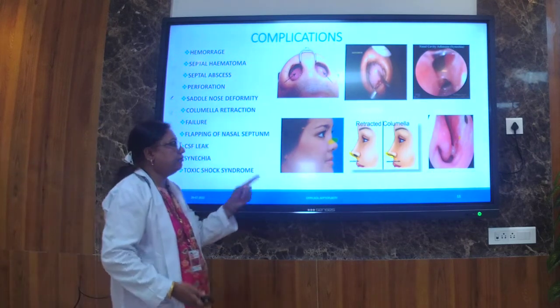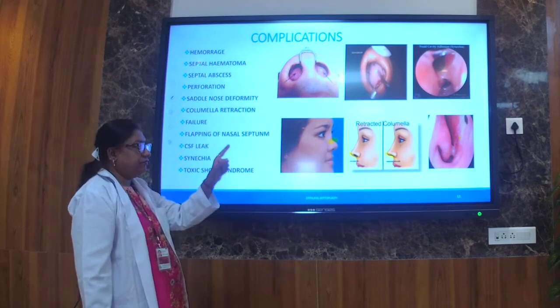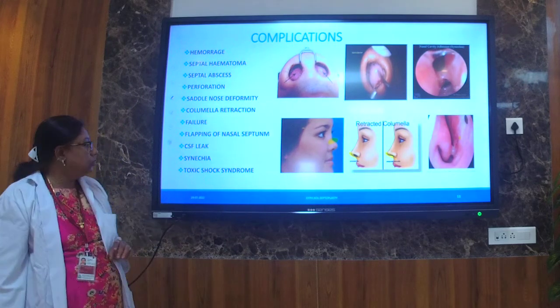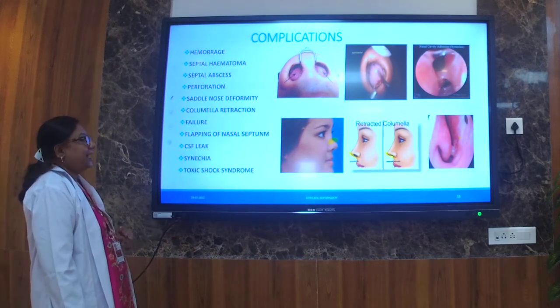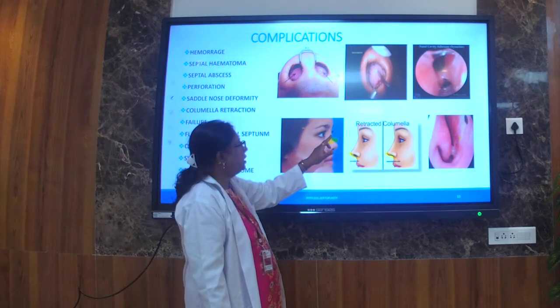We have to be very careful. Otherwise the patient will come to this. Again, this patient will need a septorhinoplasty.